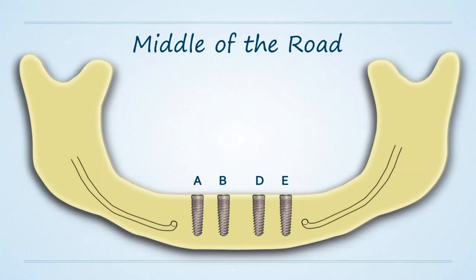If I'm, say, starting out, placing implants at the 22 and 27 position, just kind of eyeballing it, maybe 22 millimeters apart, approximately where the canines are in the patient's denture, maybe punch a couple of holes in a surgical guide, a copy of the patient's denture. Does that work? Absolutely, it works. However, I encourage you, check out this application.